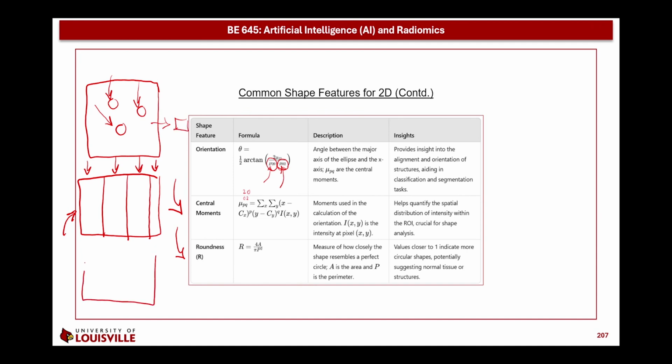So in this case, we will add here the average values of the corresponding features that reflect the ROIs. And finally, we add the class here. So depending on the application, you can optimize the classification file that will be applied to the classification process.